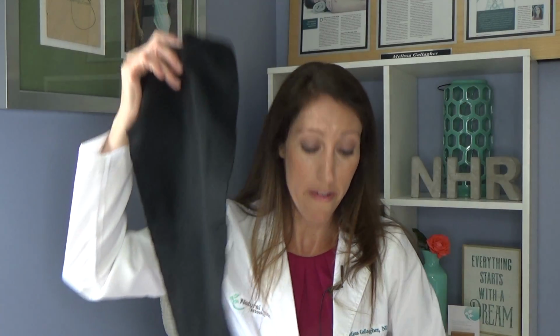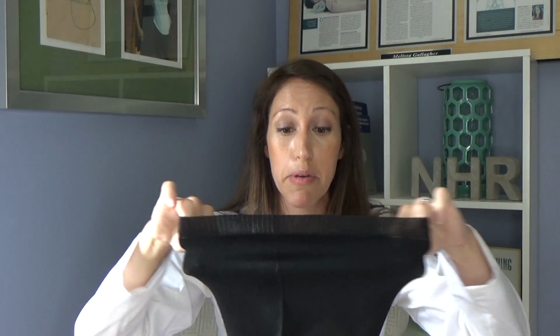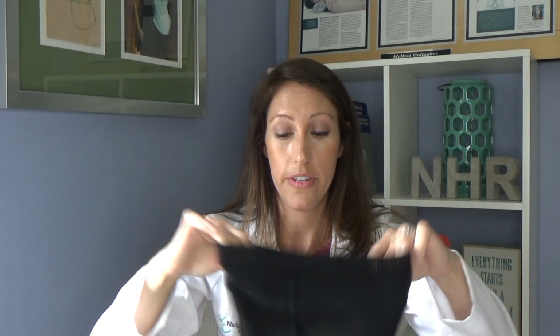Compression therapy that is higher grade, 20 to 60 is what I like to see for compression garments, and that's where we get into the Velcro wrapping. So I first want to share with you, if you're going to buy a Velcro wrap, which is what I recommend, you would be getting a stocking. And there's a lot of different types of stockings. A lot of times these stockings are already going to give you the 20 to 30 type of compression alone.